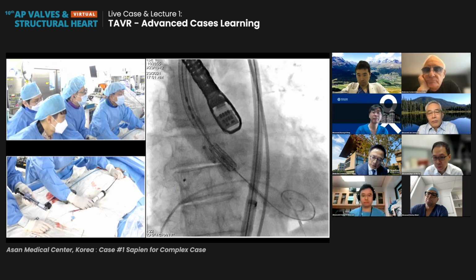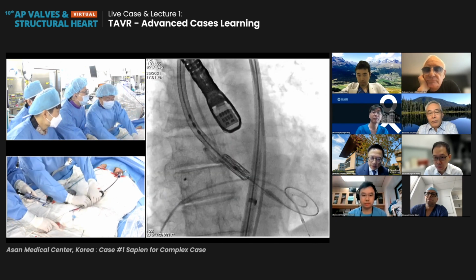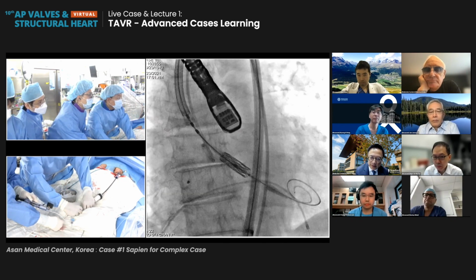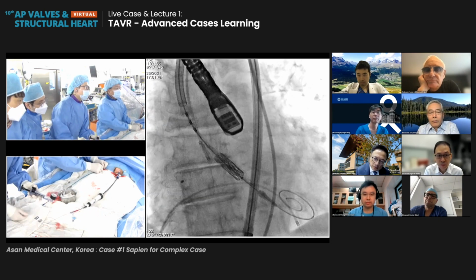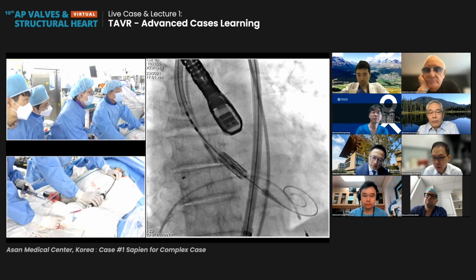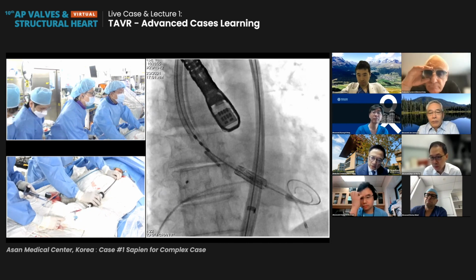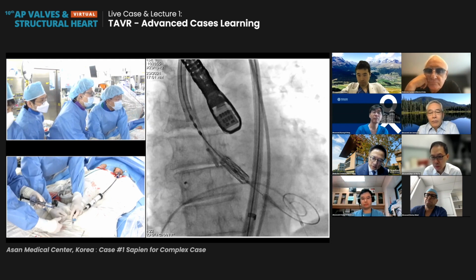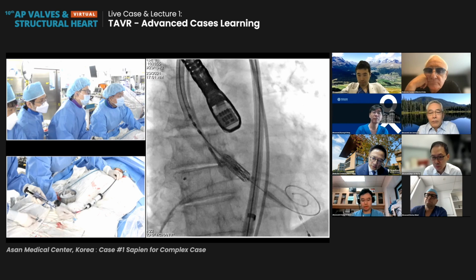Okay, still outside. I think it's okay. Good. Push, you need to come back here. All right, push out to this point. Okay, test please. All right, a little bit further. Oh, it's nice. Sound a little bit modified with LV wires. Test please.